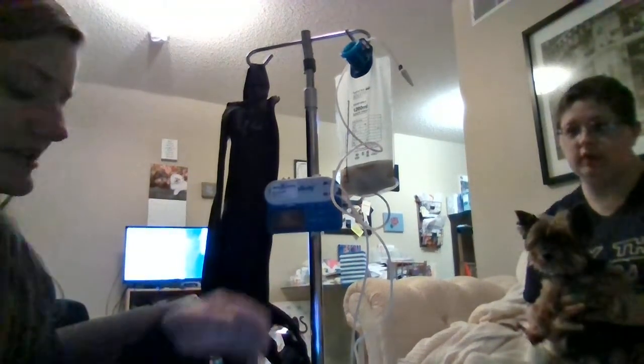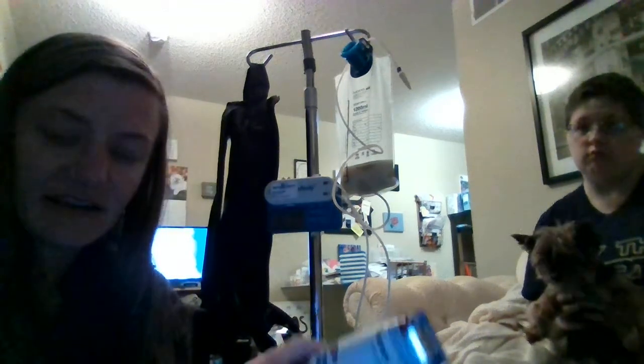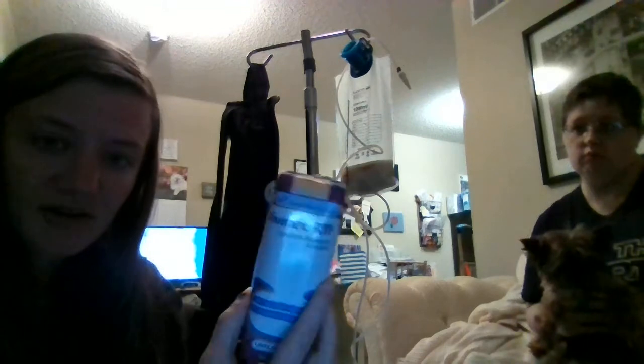Yeah, this is my feeding tube pump, and this is the formula that I'm currently on called Vivonex RTF. It's an extremely low fat, low residue type of formula. I've tried 2 other formulas, and the first one was very thick and high in fat. It would just make me feel really sick and would constipate me. So I switched to another one after that called Peptamen. The Peptamen was really good. It was not as thick. However, it continued to worsen my constipation issues. So I found out that I needed to be on an elemental formula that's 100% broken down.